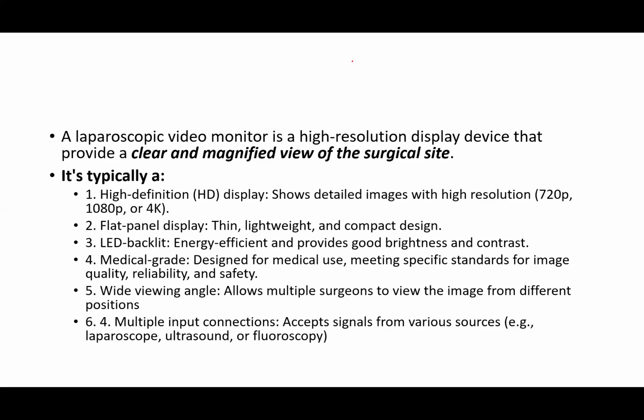It's designed for medical use, meeting specific standards for image quality, reliability, and safety. Now, it should have a wide viewing angle, allowing multiple surgeons to view the image from different positions.